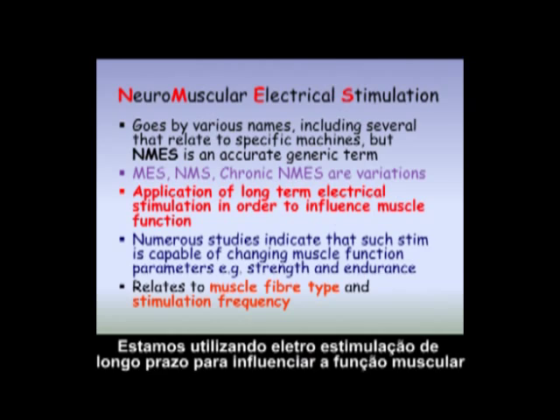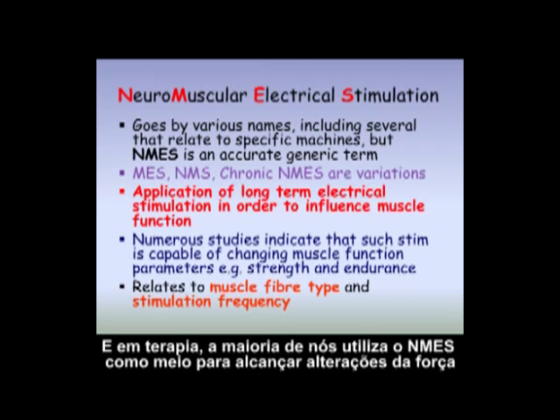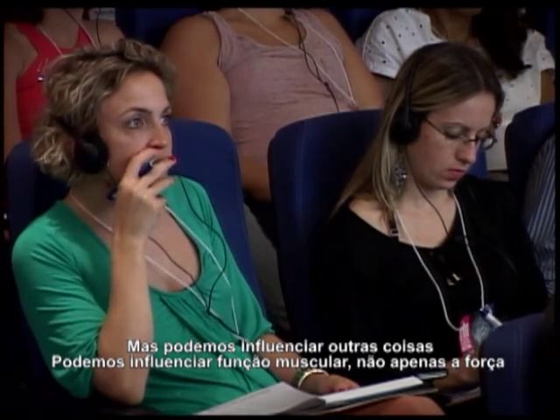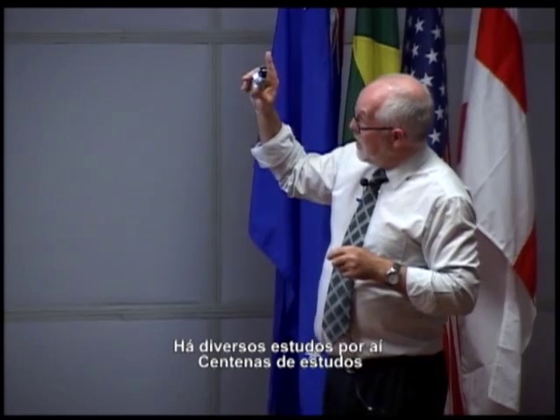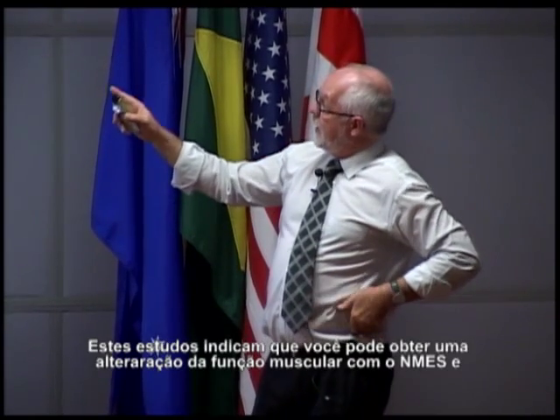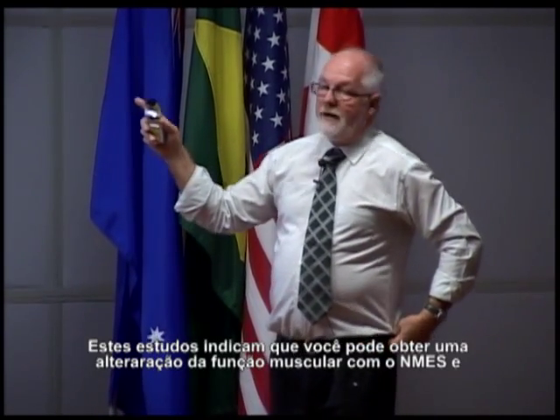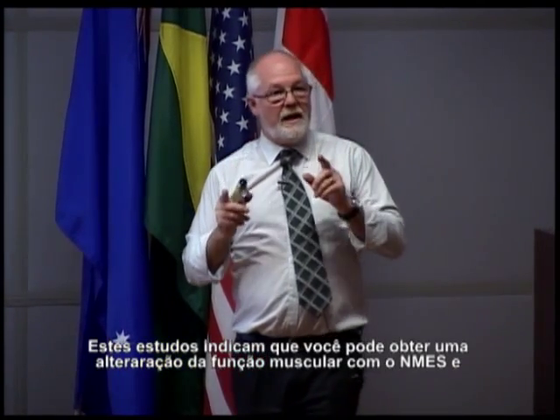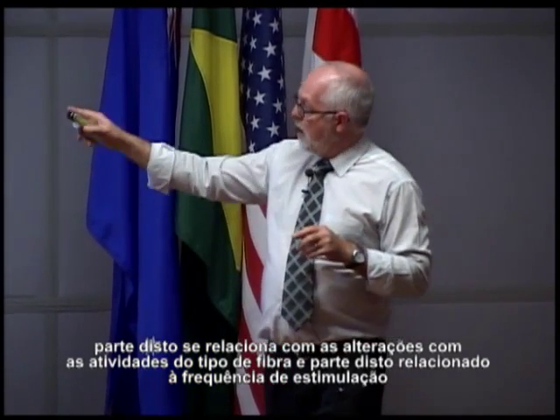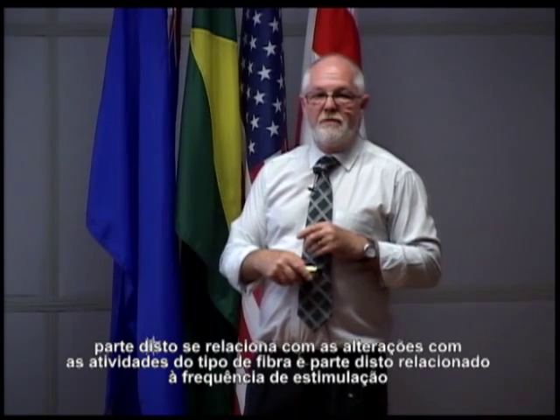We're using electrical stimulation to influence muscle function. And in therapy, most of us use NMES as a way of achieving changes in strength. But you can influence other things. You can influence muscle function, not just strength. There are hundreds of research studies out there, and they would indicate that you can get a change in muscle function with NMES, and part of that relates to changing fiber type activity, and part of that is related to stimulation frequency.